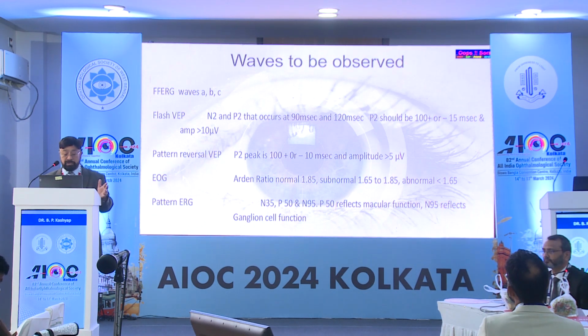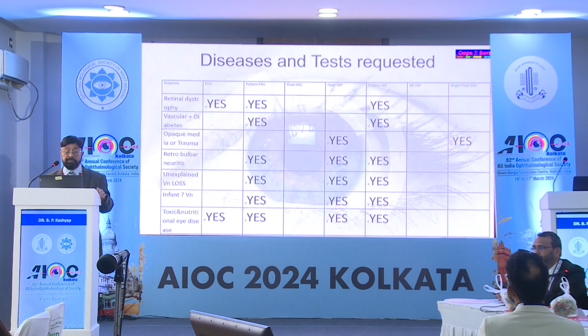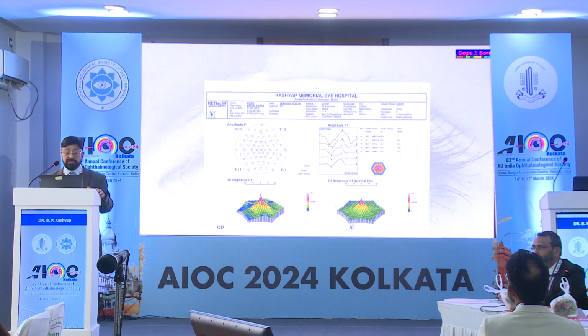Dr. Vibhuti Bhushan has talked about all the investigations to be done in which cases, and the diseases that require these investigations. The beautiful topographic representation of multifocal ERG makes it very easy to understand, give consent, and give advice to the patient.